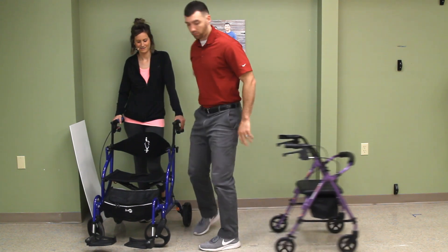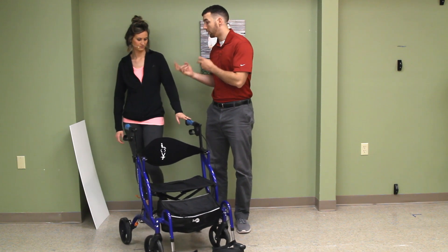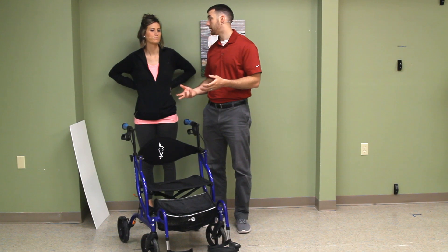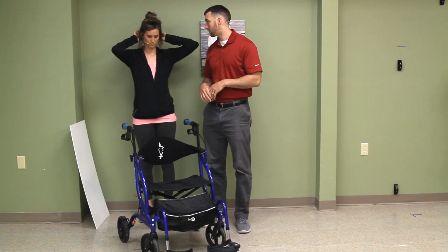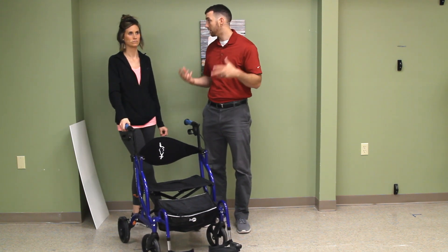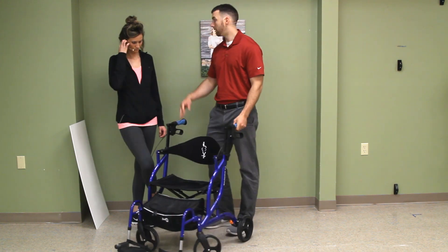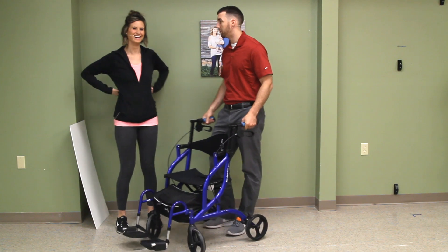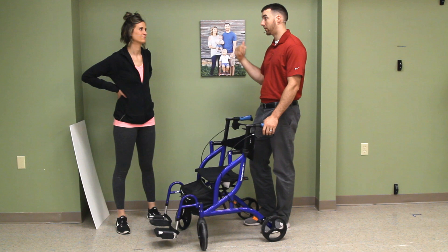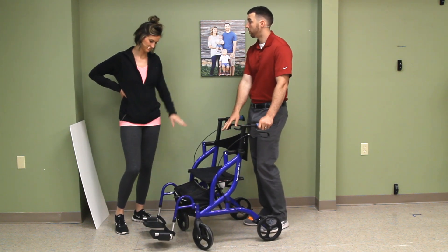We're going to explain why this is a better option for somebody who maybe can walk a nice distance but can't walk the whole distance and needs to rest. You can think of many occasions where somebody needs to be wheeled — maybe they can walk on a nice surface but on grass they need to be wheeled. Right now, as I wheeled my dear wife in here — right now we are in wheelchair form.